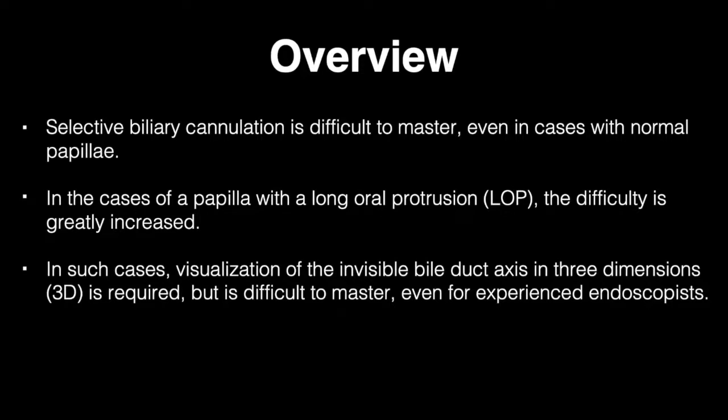In the cases of a papilla with a long oral protrusion, the difficulty is greatly increased. In such cases, visualization of the invisible bile duct axis in 3 dimensions is required, but is difficult to master even for experienced endoscopists.